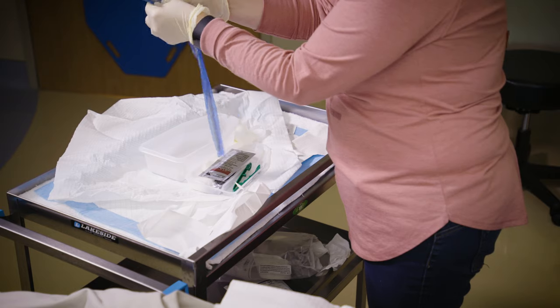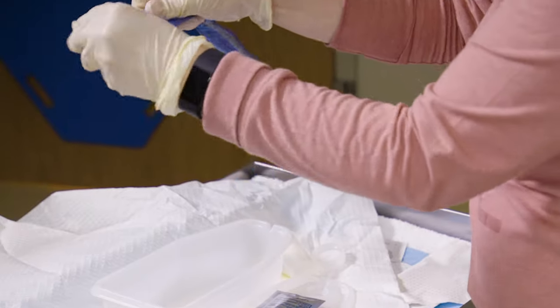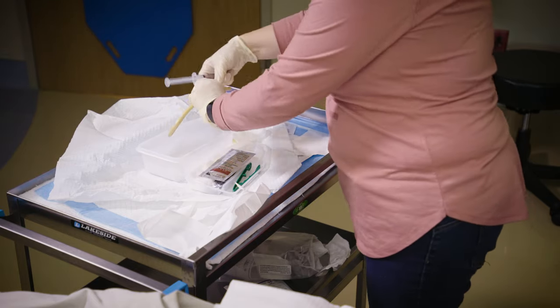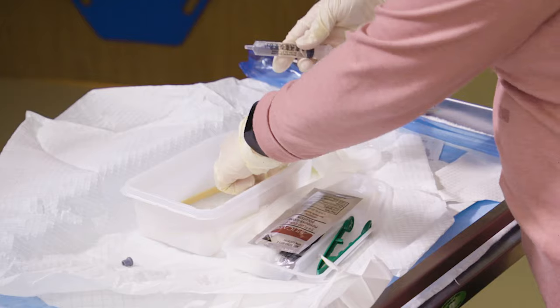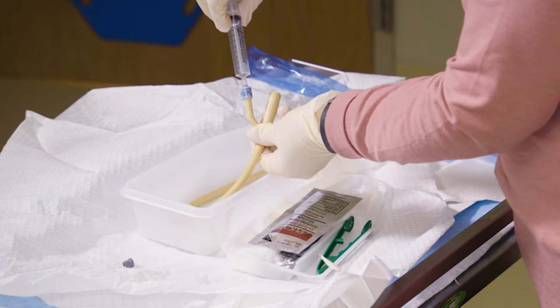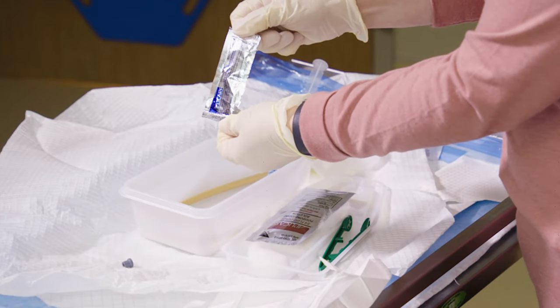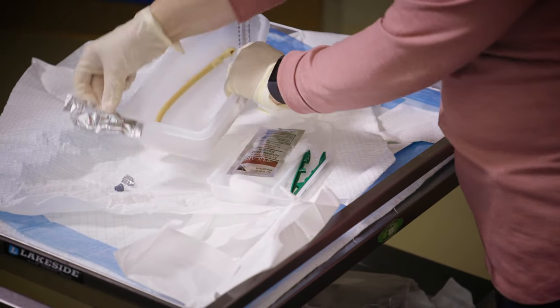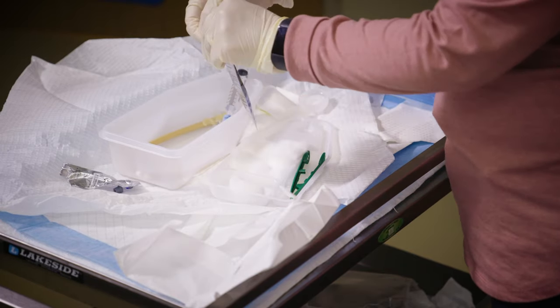Next, pick up the catheter and open it. There is a perforated edge along one side of the packaging, which makes opening the catheter easier. Once the catheter is open, place it inside the tray in a U-shape. Next, remove the cap on the filled syringe and attach it to the colored port of the new catheter. Now open the small package of lubricant, which is usually underneath the Betadyne. Generously lubricate the tip of the catheter. There are several cotton balls included in the kit. Open the Betadyne package and saturate three cotton balls.